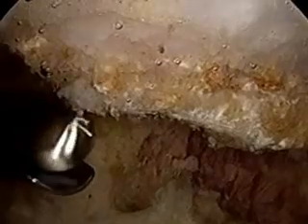And you can see here we are tying sutures again with specialized arthroscopic instruments through what's called a cannula. This suture, although it looks rather large on the screen, is actually very small and very, very strong. Here you see the sutures that have been passed through, tied down, and as we're moving the arm you can see that entire rotator cuff, which has been repaired, moves as a unit.